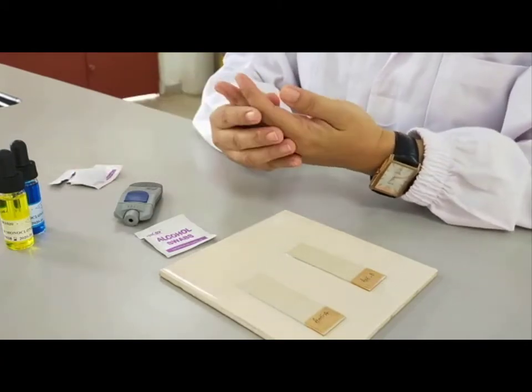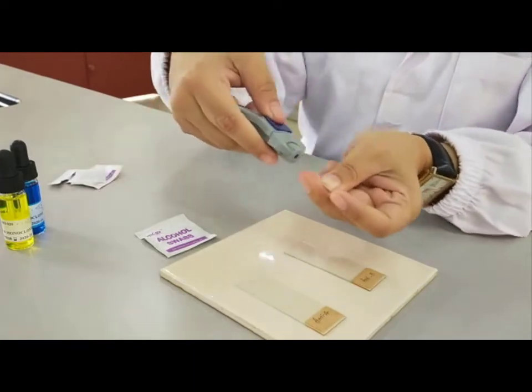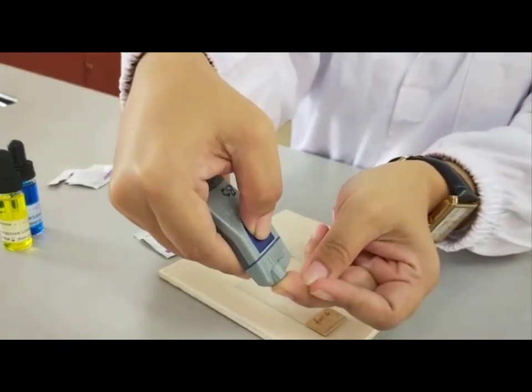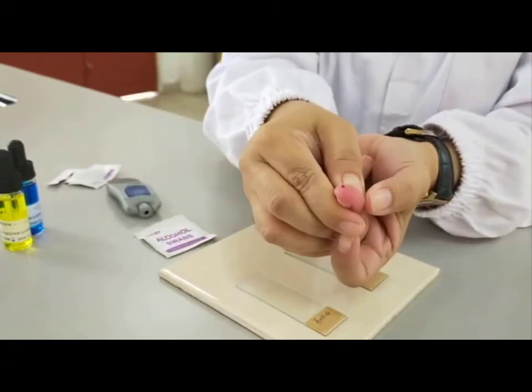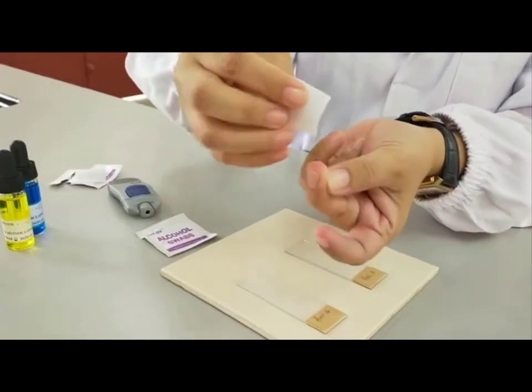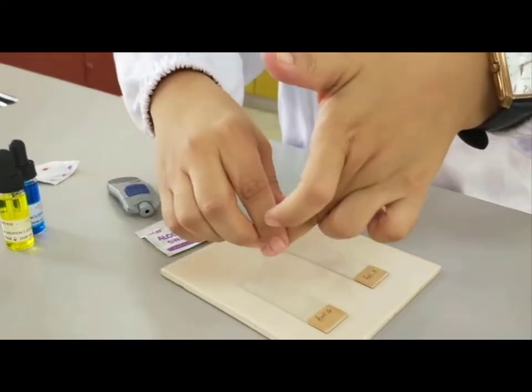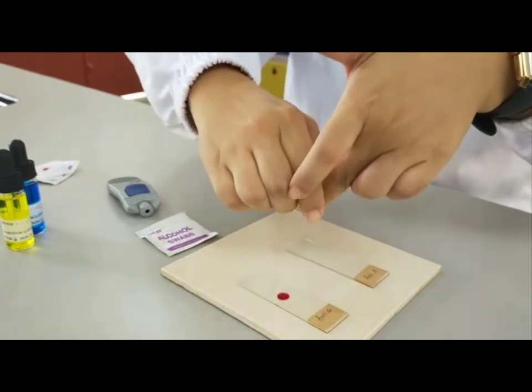Take the lancing device, and press the button, and use a new clean alcohol swab and clean the first drop. So now you have to place the next drop at the center of each of the slides, slide 1 and slide 2.